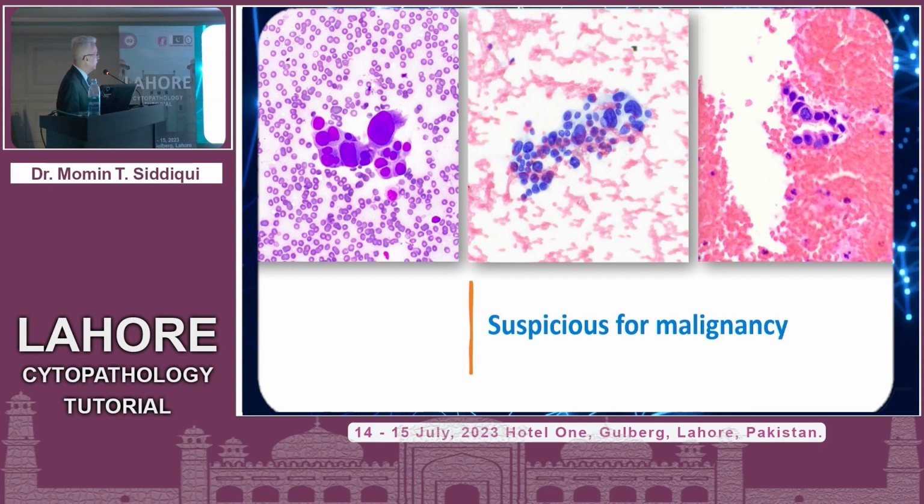Case number 1, this is a DiffQuick, and this is all that I had. About 10 cells, but giving you pleomorphism and quite a bit of anisonucleosis, size variation. Look at the nuclear membranes, hyperchromasia, if you may want to think of that based on this DiffQuick. And then this is the Papanicolaou stained smear, similar situation, quite a few cells here, but again, this is the only focus. Anisonucleosis, hyperchromasia, even prominent nucleoli noted.